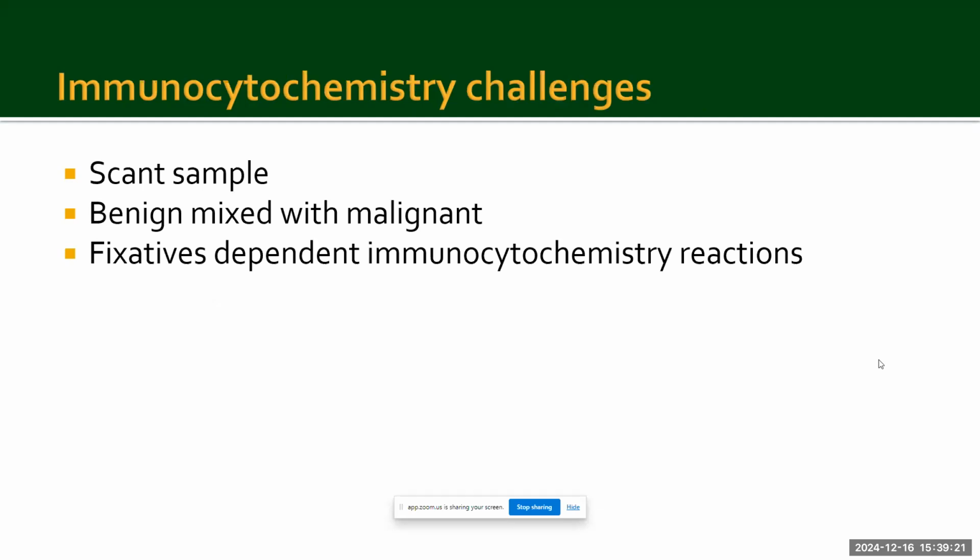Well, I think that is true in any cytology specimen. You see some cells in the cell block, and you are comfortable to call it malignant, but it turns out to be such a scant sample that the immunocytochemistry stains done in the next level won't have any of the lesional cells. Then you basically base your diagnosis on the morphologic interpretation.